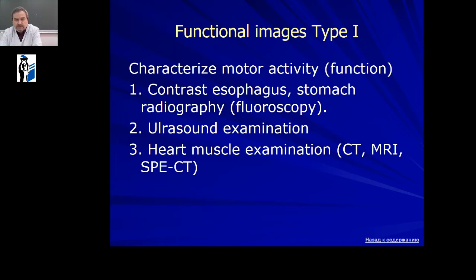Functional images type 1 characterize motor activity or motor function. For example, first example, contrast esophagus or stomach radiography or fluoroscopy.